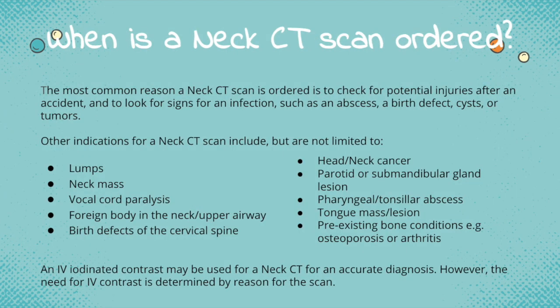done. So when is a neck CT scan ordered? The most common reason a neck CT scan is ordered is to check for potential injuries after an accident and to look for signs of an infection such as an abscess, a birth defect, cysts, or other tumors. A neck CT may also be recommended when planning for neck surgery, radiation therapy, or a biopsy.